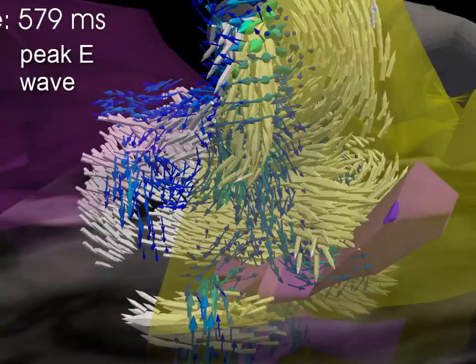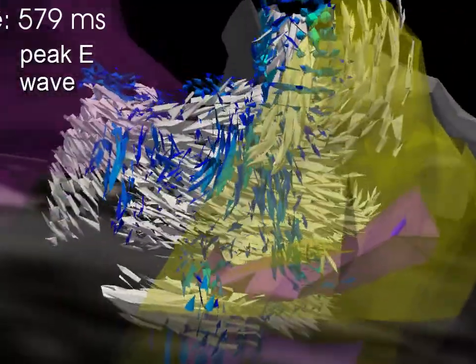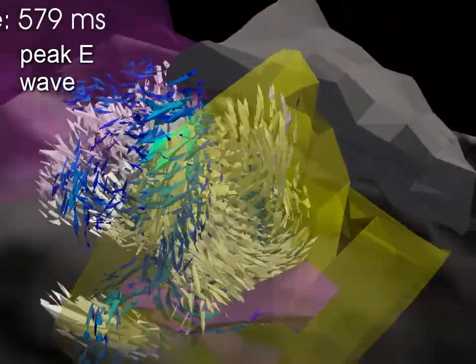The pulmonary valve regurgitation continues to drive vorticity and recirculation throughout diastole.